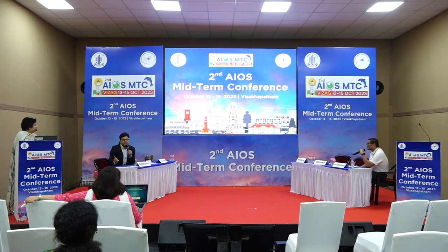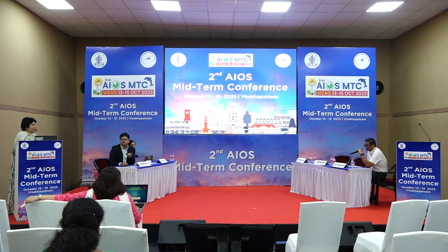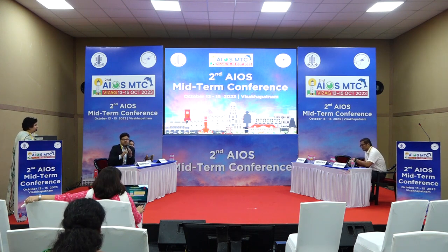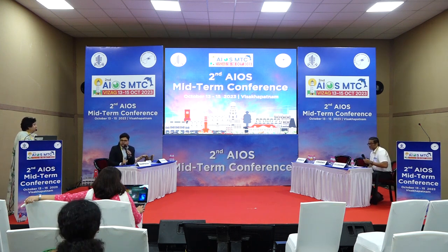One important point, as ma'am also highlighted, is please clear all the mucus and everything from the ulcer bed before going for scraping. Could you just tell them why it is important to scrape from the edge as well as the base? The advancing edge has the organisms multiplying, so you don't get debris or necrotic material if you scrape from the advancing edge. Some organisms like Moraxella are found in the base only, so if you just scrape off the edge and leave the base, you may miss such organisms.